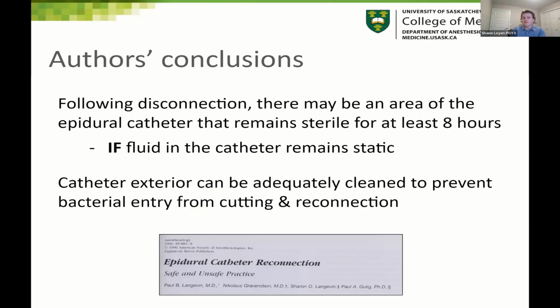So their conclusions from this study: they found that following disconnection, there may be an area of the epidural catheter that remains sterile for at least 8 hours. And that's pending if the fluid in the catheter does remain static, so the meniscus level is not changing. And they concluded that the catheter exterior could be adequately cleaned to prevent bacterial entry from cutting and reconnection.